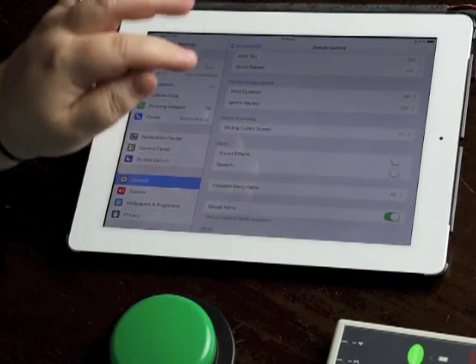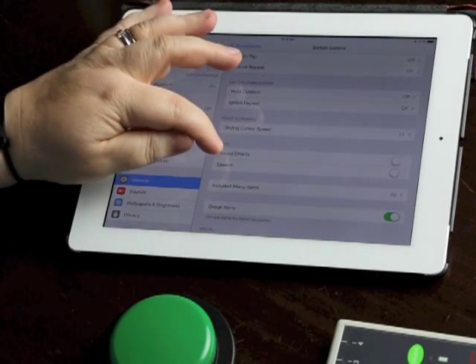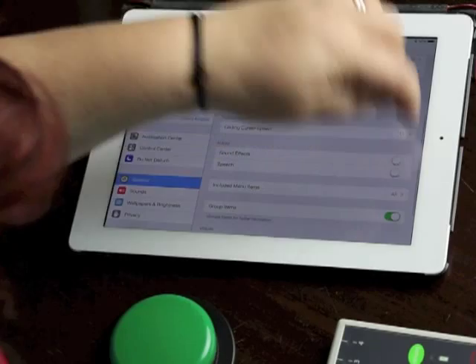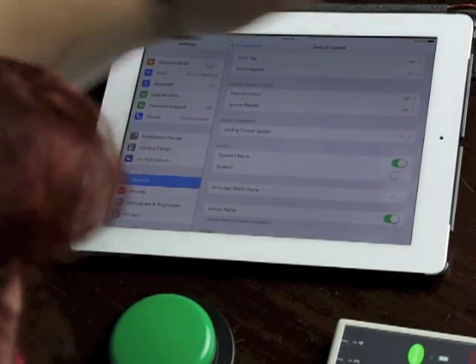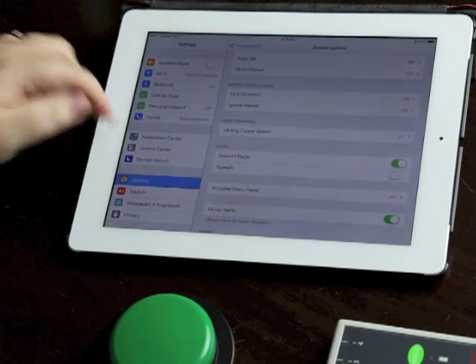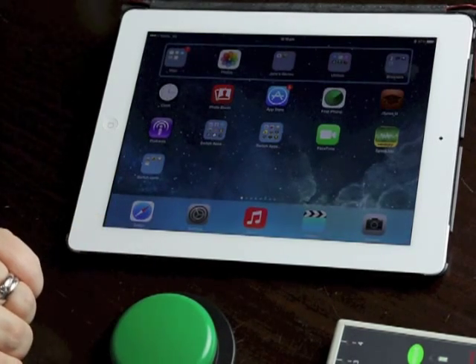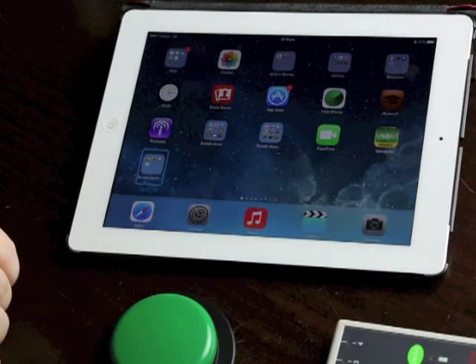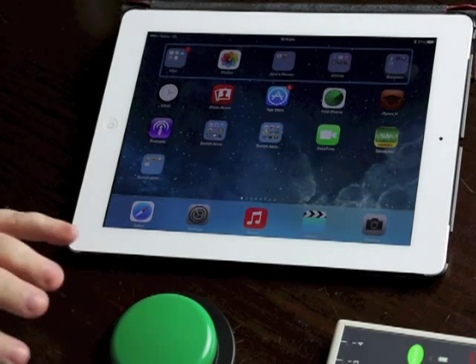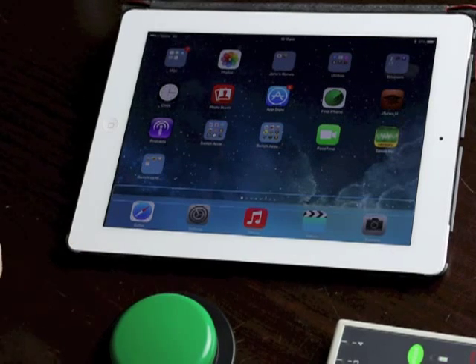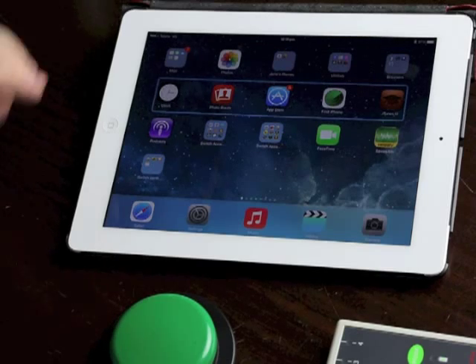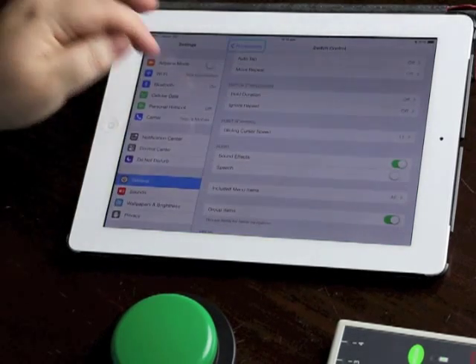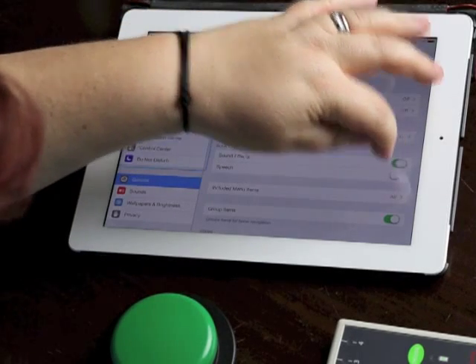Gliding cursor speed is the next setting and we'll have a look at the gliding cursor later on. Now, sound effects, so in here I can go and turn on a click noise. So let me get out of this, start scanning happening, you can hear that click noise as it moves around the screen. I know many users that like that click noise particularly when they're learning scanning and I know lots of people who don't like it so it's there as a setting if you need it. Let me go back into settings and we'll turn that click off.